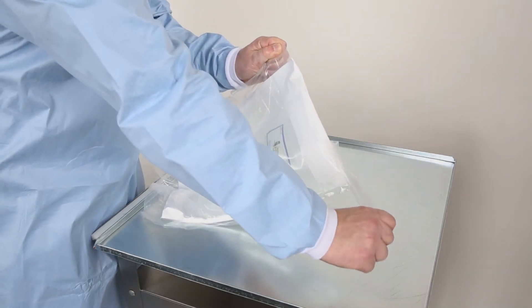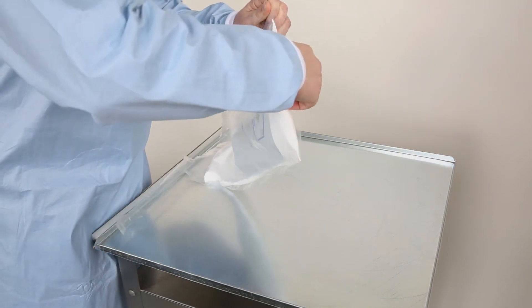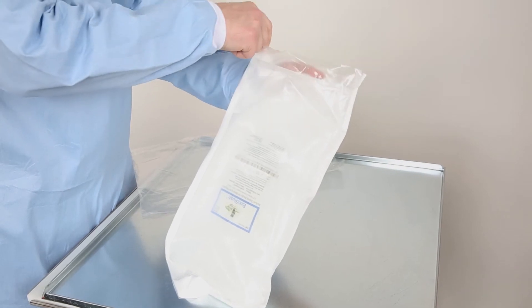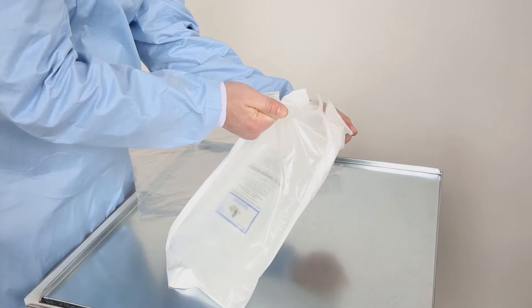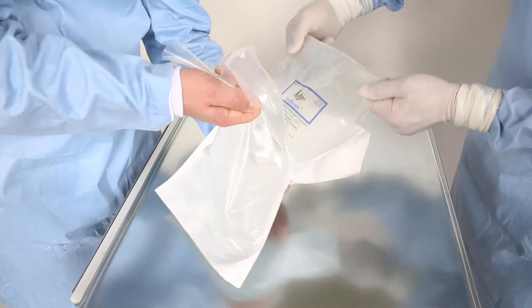Continue the preparation by removing the clear outer plastic wrap using the notched perforation near the top of the outer bag. Next, peel back the Tyvek bag by grasping the upper edges to begin separating the bag's seal.